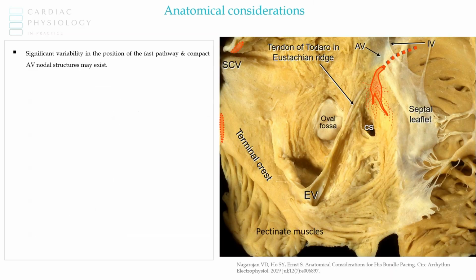We've gone over the anatomy of the triangle of Koch before, but it's important to reiterate the point in the context of ablation of slow pathways. Here we can see a beautiful illustration of the triangle of Koch, and this is from a paper actually looking at His bundle pacing, but we've appropriated it for our purposes because it beautifully illustrates the area.